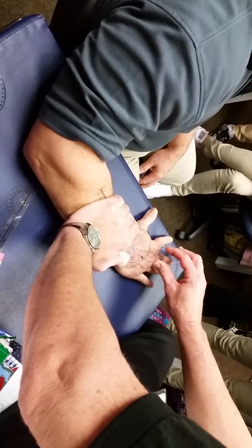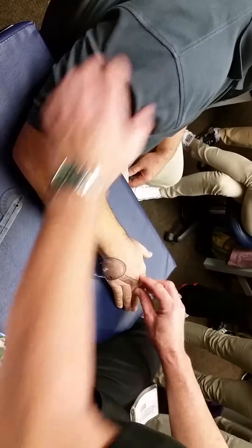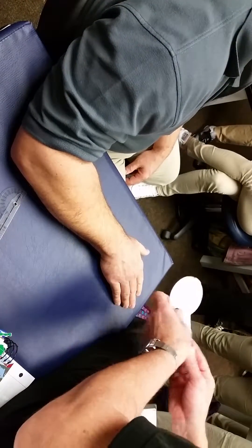Make sure that you're stating those landmarks. Pretty easy measure. It's nice and flat on the table. The only thing you've got to do is make sure that the elbow's back to 90 degrees.